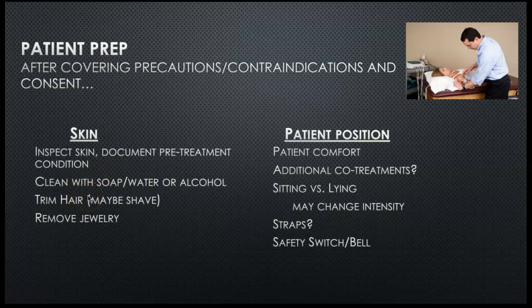Then you clean the area that you're going to put the electrodes on. Now, in our lab and in tons of clinics, people use alcohol wipes to clean the skin before they put on electrodes. And I will say it's good in that it makes the electrodes last longer because it cleans the oils off the skin. And so those electrodes don't get oily, and therefore they stick longer.